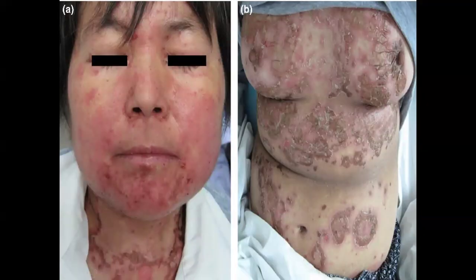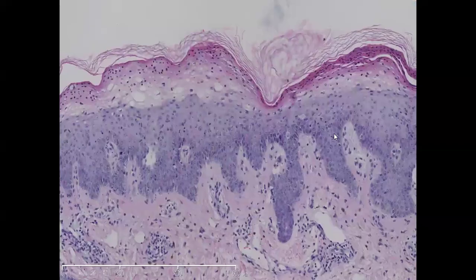This is another acute condition characterized by epidermal necrosis, but this necrosis is in a ring or annular fashion. This is glucagonoma syndrome, or necrolytic migratory erythema, and this is characterized by epidermal necrosis and light colored keratinocytes, which are the start of epidermal necrosis.